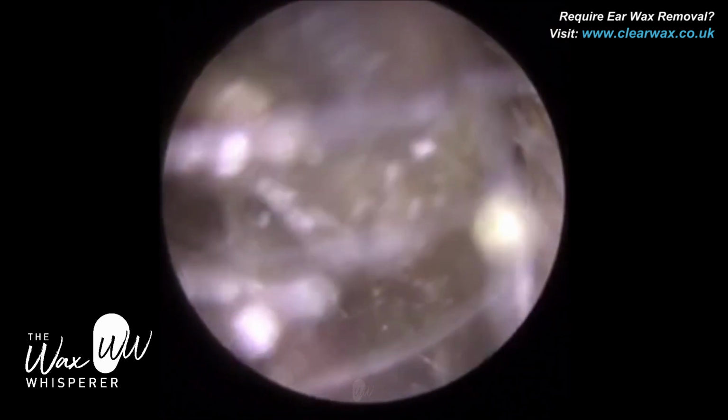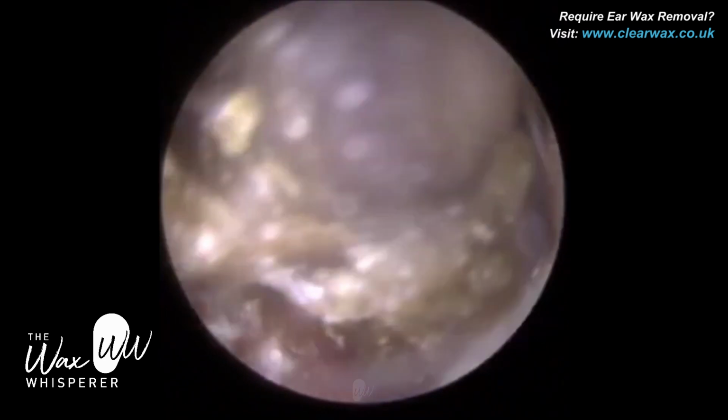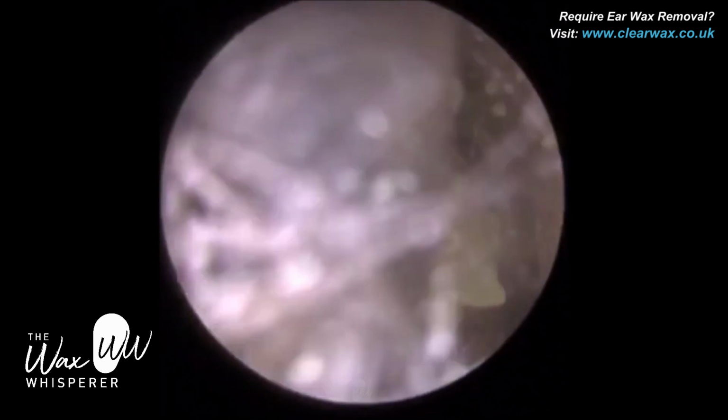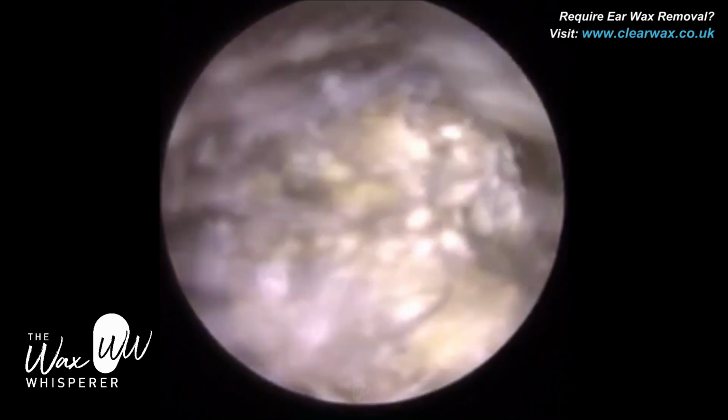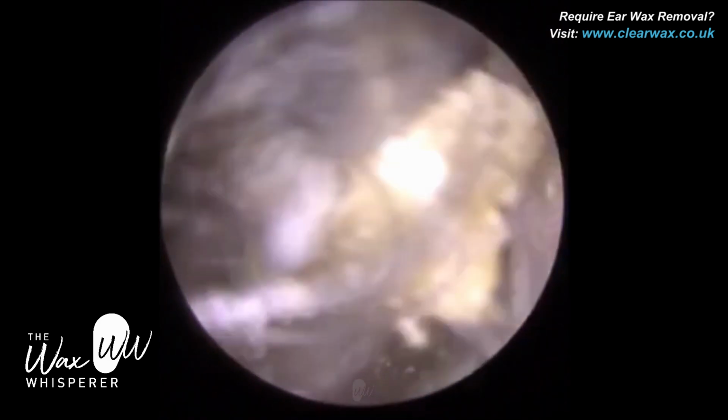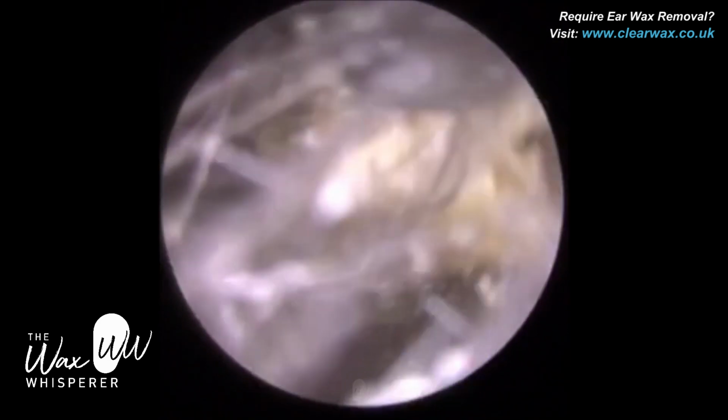And this skin can act like double-sided sticky tape. Not only does it stick to the ear canal wall, it also sticks to the plug of wax. I'm just trying to mobilize it. And because this plug of wax is extending all the way to the patient's eardrum, so almost 2.5 centimetres in length, it's also trapped within the isthmus.